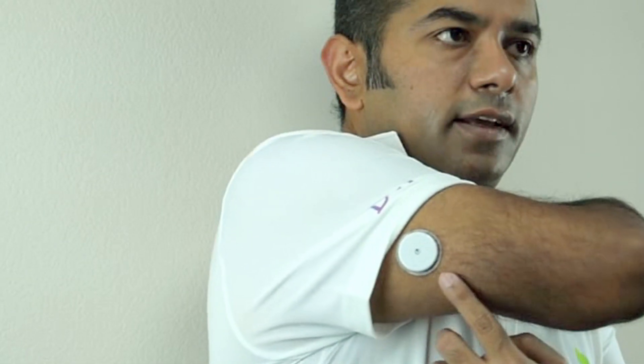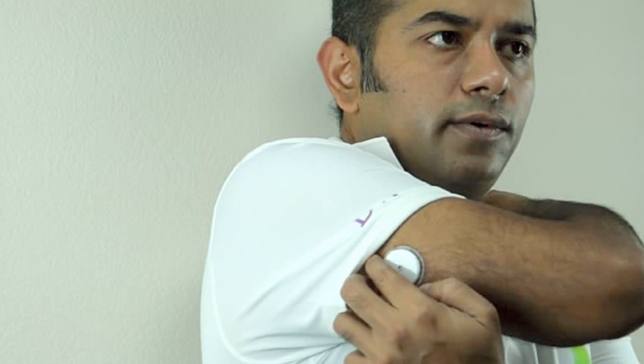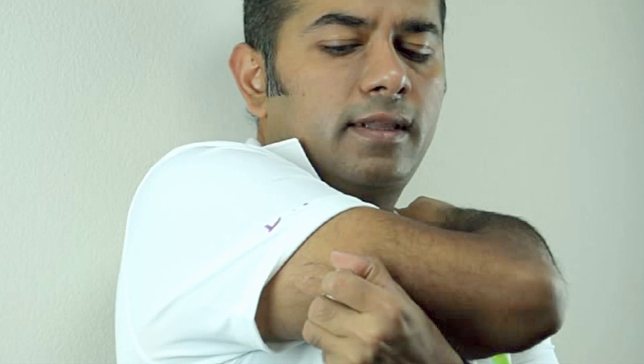So now I'm going to show you how to take the monitor off after 14 days of use. Right here is my monitor as you can see. Taking it off is simple — all you do is gently pull away from your arm. And that's it — that's how simple it is to take the monitor off.